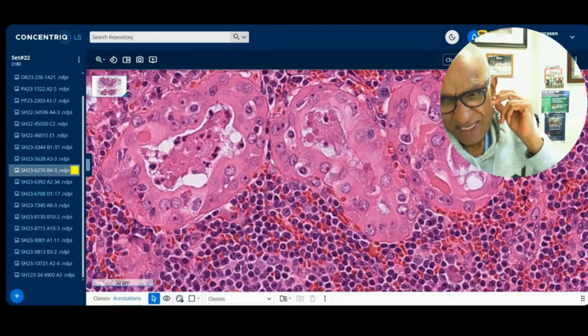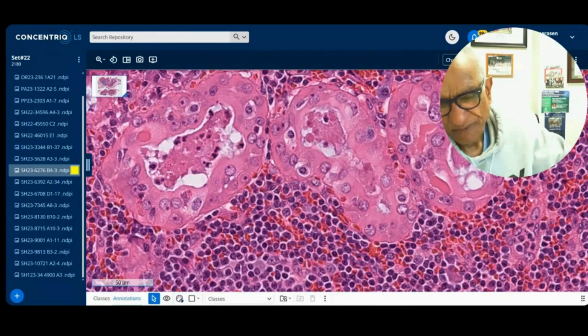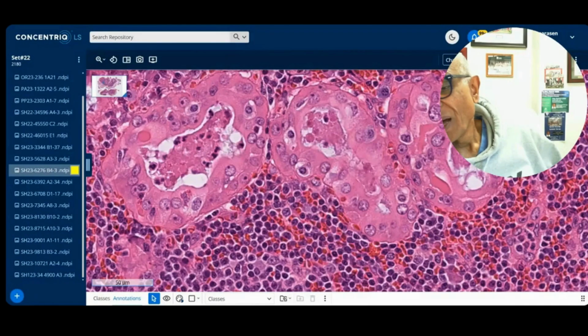Then there's myoepithelial cells. So these are clearly epithelial, but they do not show any of the myoepithelial markers. P63 is positive in the pink cells, but that alone does not make it myoepithelial. The calponin and S100 are negative, so the markers for myoepithelial are negative. Lymphoepithelial lesion, somebody mentioned that earlier with oncocytic. Yeah, Mohammed, oncocytic epithelium was a good thought. Thank you, Premila, for bringing that back in. Mohammed, oncocytic mucoepidermoid, but cannot explain the lymphoid.